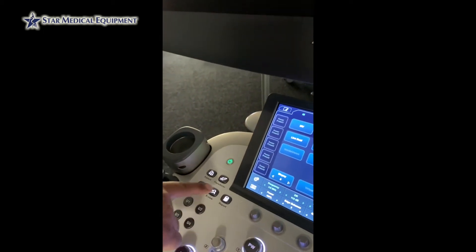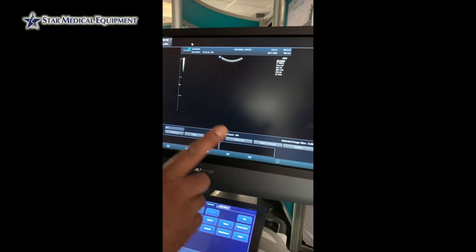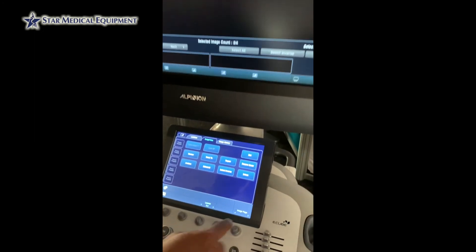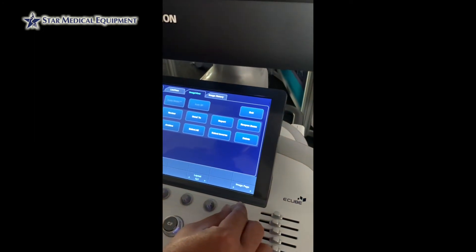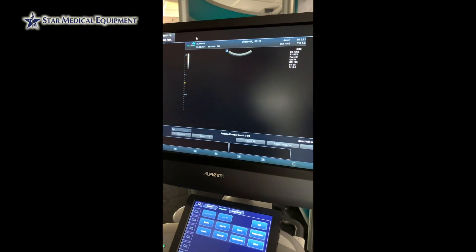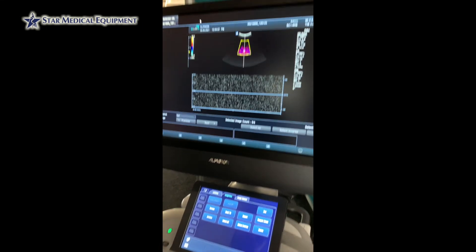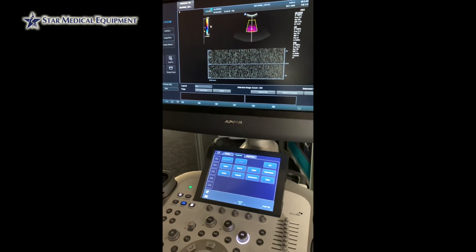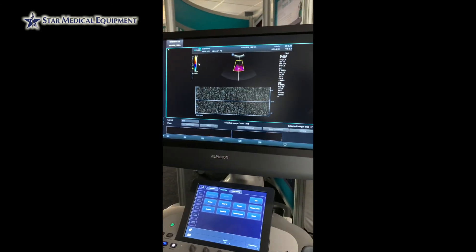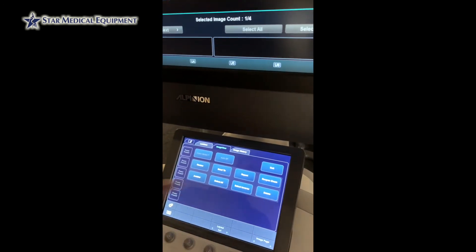If you wanted to review the images with a larger viewing area, you can select a view. When selecting a view, you now have the ability to scroll through the images using image page, and you can also delete images from here as well. If I select this image right now, you'll see that it's now highlighted and you have the option to delete it.